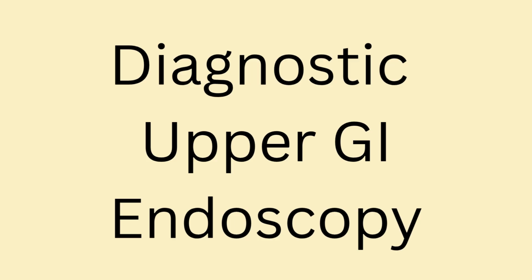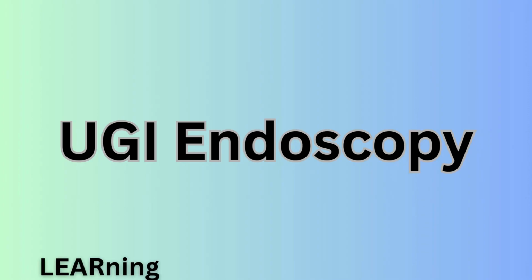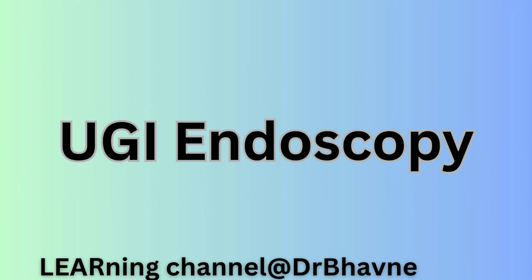Welcome to this step-by-step guide on diagnostic upper gastrointestinal endoscopy, also known as esophagogastroduodenoscopy or EGD. This essential procedure allows direct visualization of the esophagus, stomach, and duodenum to diagnose and treat a wide range of upper GI conditions. The procedure begins with patient counseling and obtaining informed consent.